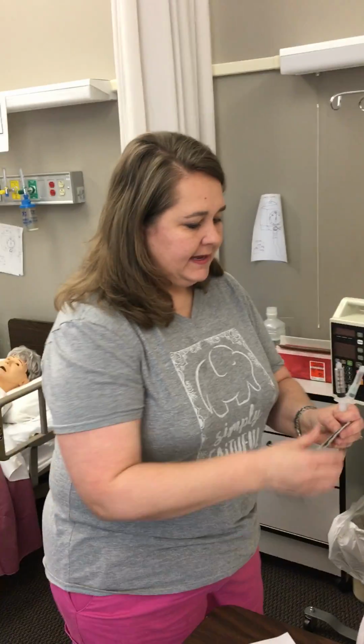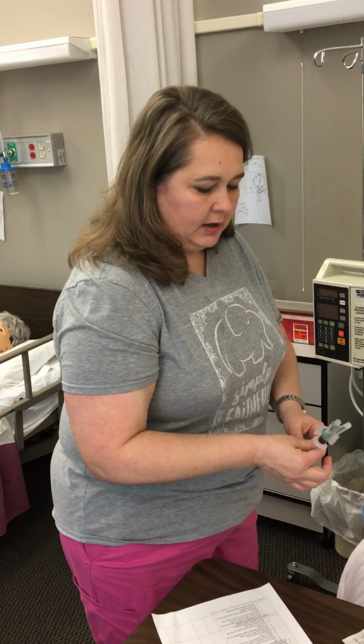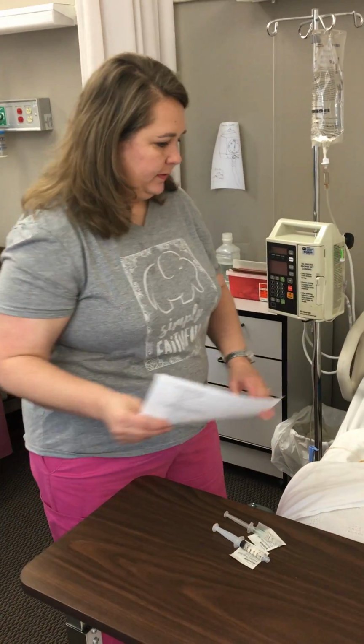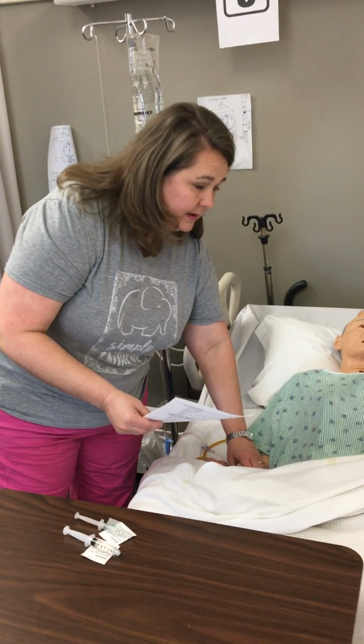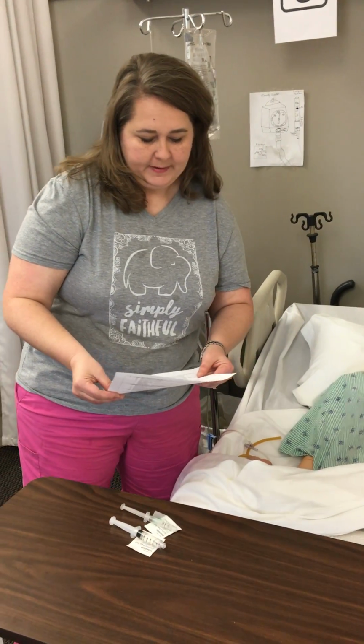Good morning. I'm Candy Anderson. I'm your nurse today. I have some IV push medications that I'm going to give you that the doctor has ordered. Could you state your name and birthday for me, please? And I'm going to verify that I have the correct patient. I'm also going to check your ID band and make sure this is the correct patient with the correct birth date. So I have the correct patient.